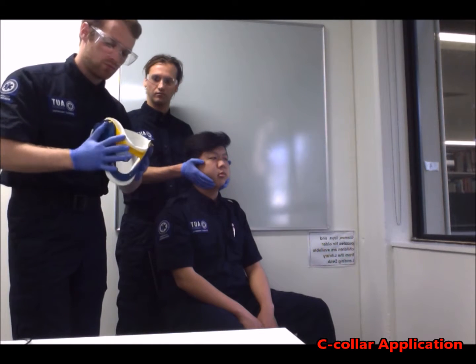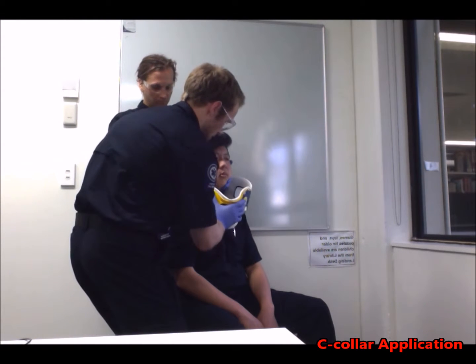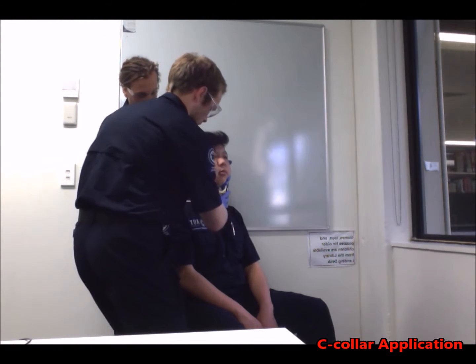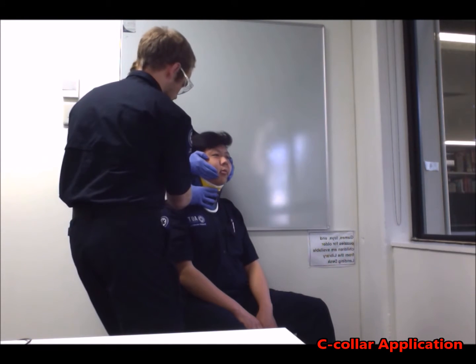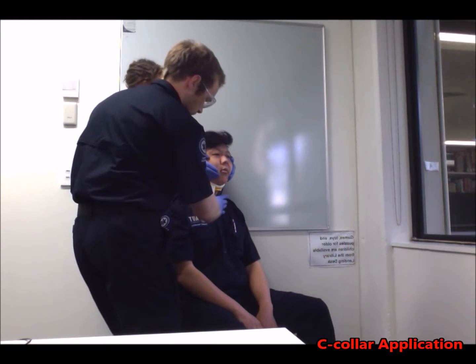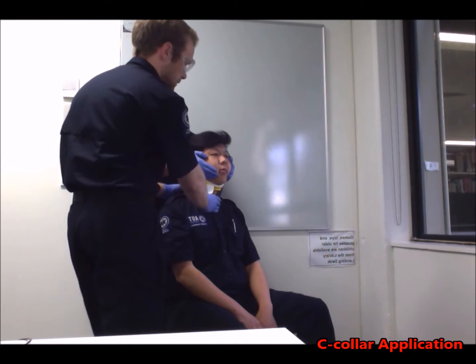Just bends. Now I'm going to come around the front of it. Bruce, I'm just going to put this around your neck, alright? Yeah. Come right round. Just Velcro strap. Now Bruce, that's a little bit uncomfortable, but it's going to stabilize the C-spine, is that alright? Yep.